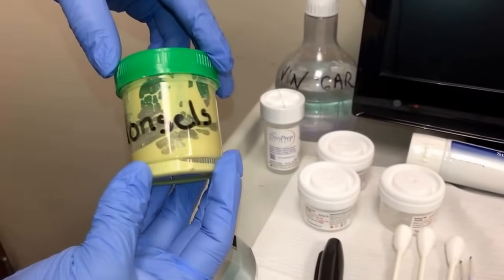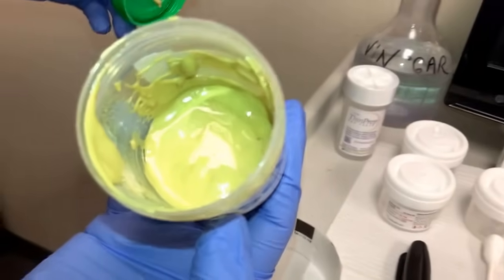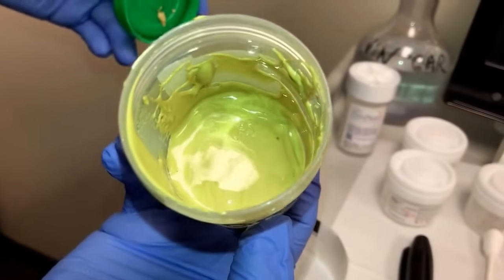This solution here is called Monsell's. It has a mustard-like appearance. This goes onto the cervix, which then comes out looking like coffee grounds.